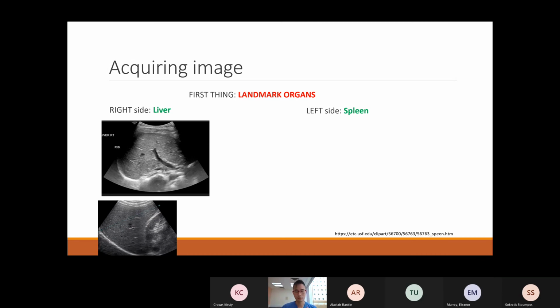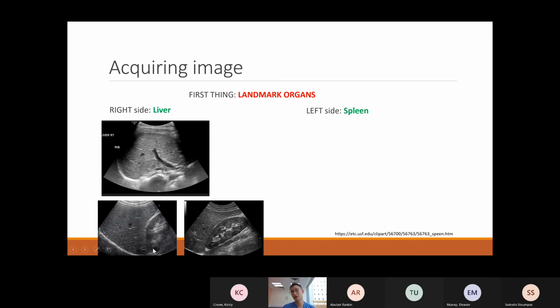That's a good start. And once you bring your probe closer to the feet, now, before I go there, remember that I mentioned before to orientate yourself correctly. So the left side of the image is the head of the patient, and the right side of the image is the feet of the patient. And so as you scan downwards towards the foot of the patient, then your kidney will start peeping into view, and then there you will have your kidney.